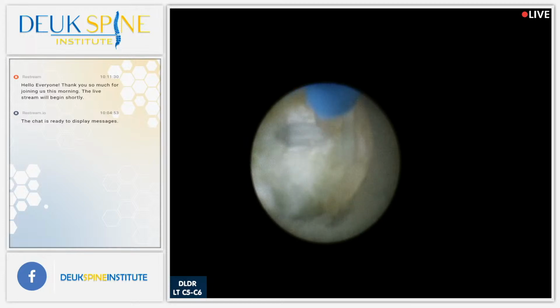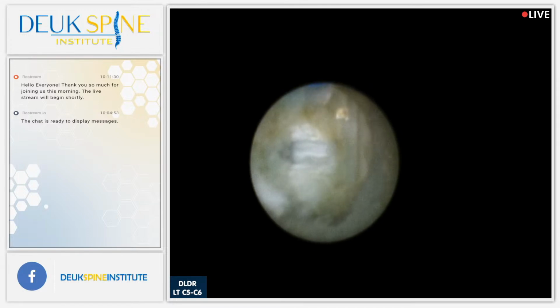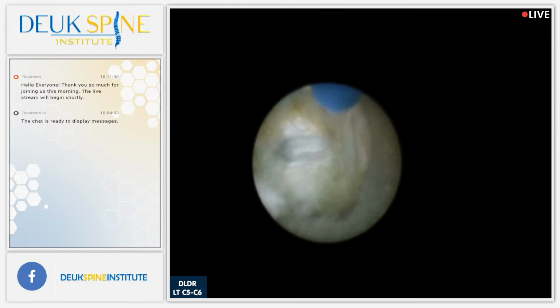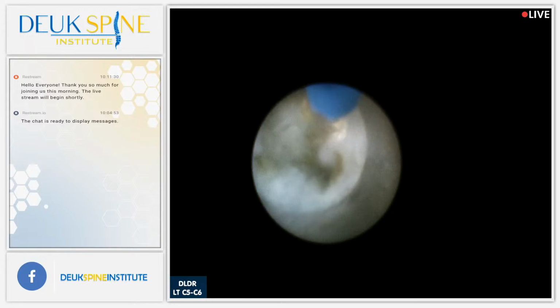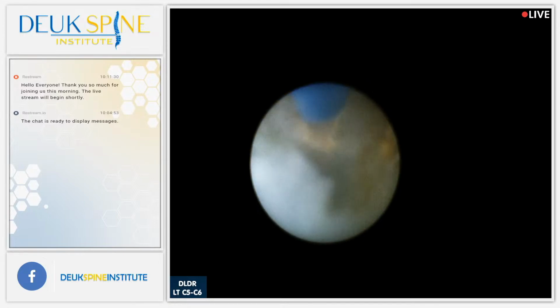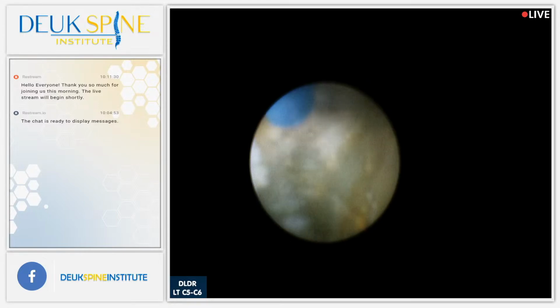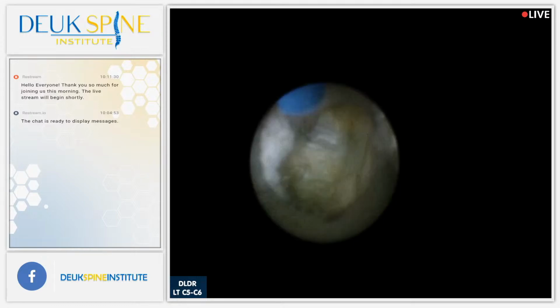So that is the tear in the posterior longitudinal ligament. That's the spinal cord right there, that white thing we're seeing. So he actually has a traumatic tear from his car accident many years ago. How many years ago was it? 5 years ago. Makes sense. This looks like a 5-year-old damaged disc. So he had a car accident and he tore the disc. He got an annular tear, and that's what we're fixing now.